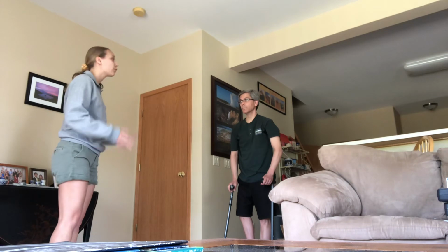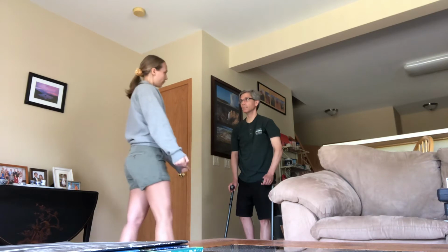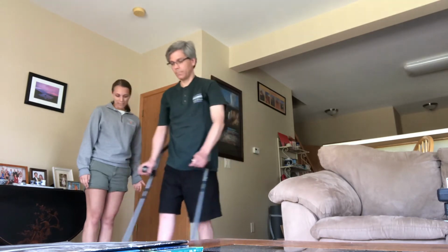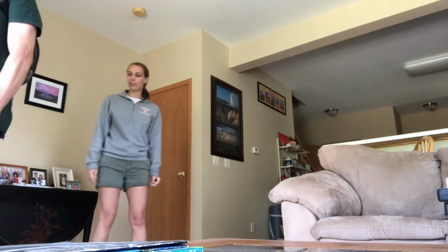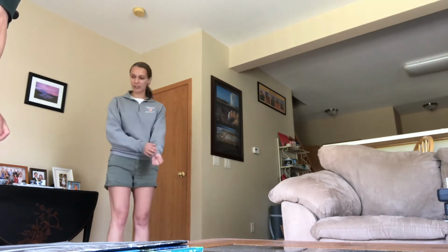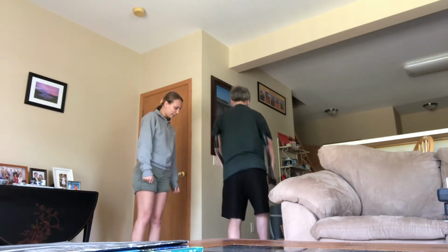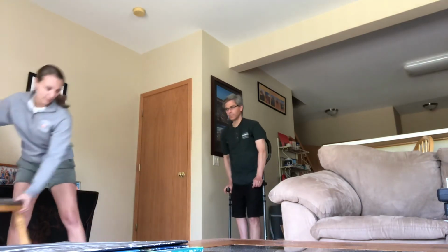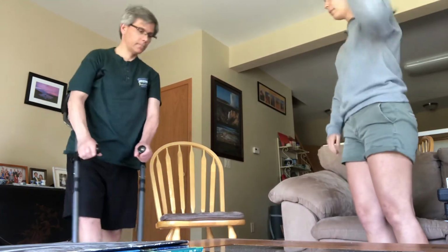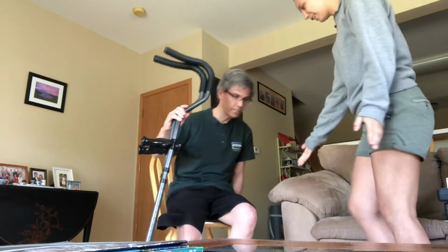And you can start with whichever leg you feel comfortable with. So you can start with your left and then move with your right, or start with your right and the crutches and then move your left. Does that sound okay? Yes. Okay, so if you want to start for me. That's perfect. Okay, how does that feel for you? Fine. Okay, and they look obviously like they fit very well, so they're right at your elbow crease, or your wrist crease, and we'll have you walk back. Okay, that's perfect. Okay, so then I'll bring this back over here, and then we'll have you sit back down. So then kind of similar to what we did before, you'll just put them both over to your right. Lovely, good job.